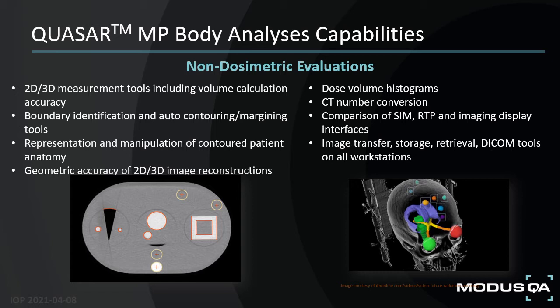However, what's also particularly interesting is that since all these tests can be done within the same body phantom, you can also directly check your image's conversion or transfer process along the way. And although not commonly occurring, computer errors stemming from improper image transfer, storage, or DICOM retrieval can accumulate and amount to improper target volume identification. And of course, with that improper target volume identification, it can eventually lead to inaccuracies in treatment planning and possibly over or underexposing the patient with the radiative dose.